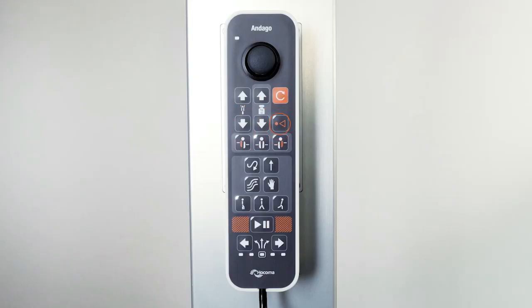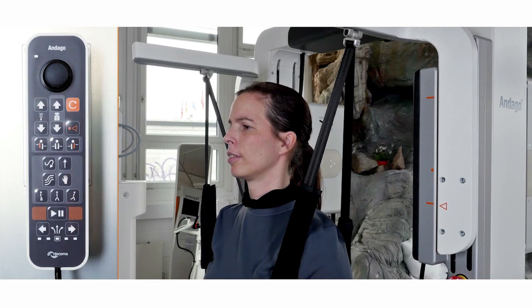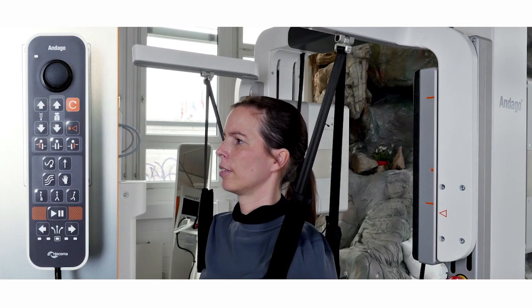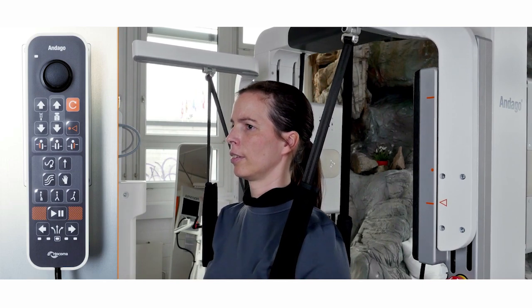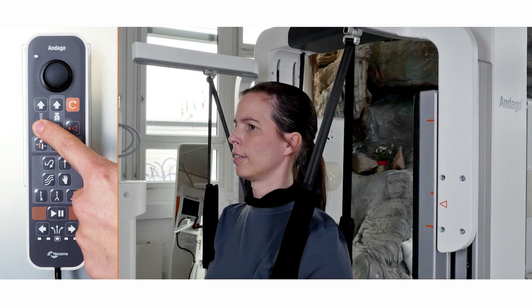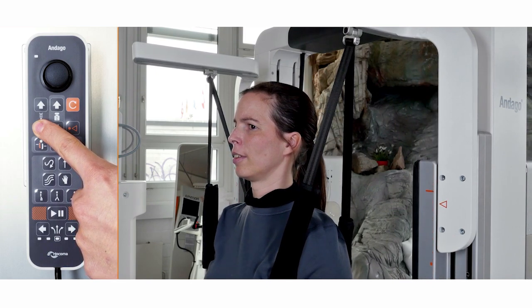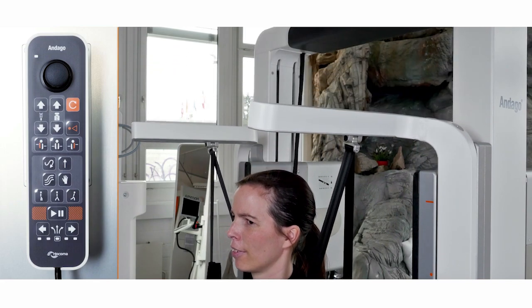You can increase or decrease the vertical displacement by moving the suspension carrier up or down. If you move the carrier up, you will increase the upward vertical displacement, and your patient will be able to step over or onto taller obstacles. If you move the carrier down, you will increase the amount of downward displacement, and your patient will be able to do bending exercises like squats or balance exercises. Use the lift button to adjust the carrier height.